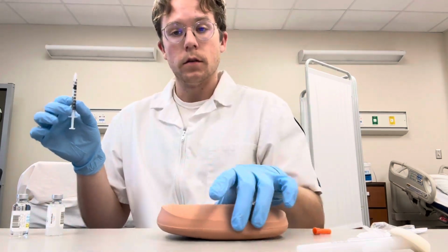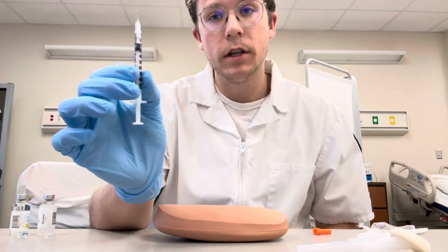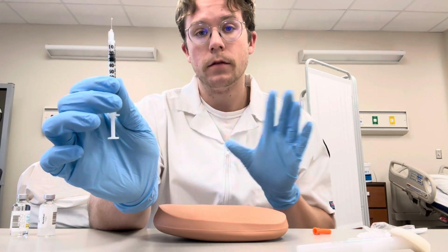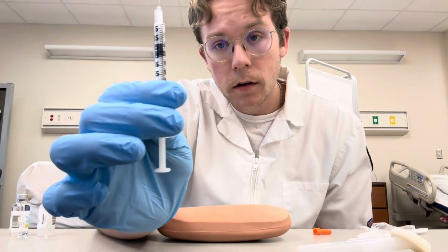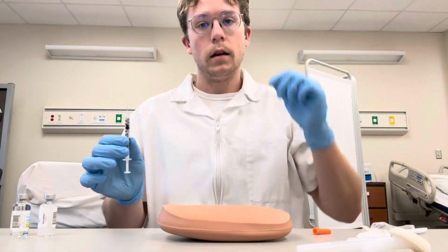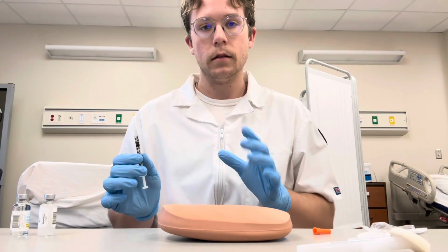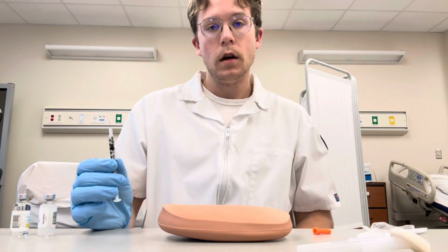Okay, so we have our insulin syringe ready. We will double check with another nurse to verify our insulin dosage, and we have 22 drawn up here. All right, and if we would be pulling this up outside of the patient's room, we would label the syringe and make sure that we have the correct syringe, insulin, and dosage labeled.